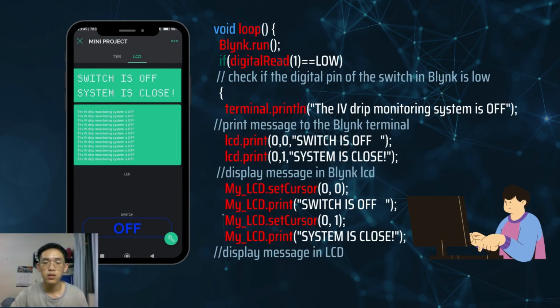Next, the code continues with void loop. Under this, the code will loop and execute line by line. The Blynk.run function enables the Blynk routine for keeping the connection alive, sending data, and receiving data. Then, the if statement checks the state of the switch, which is initialized by pin number 1. This switch is turned off by the nurse using the Blynk app, and it causes a temporary close of the system when the nurse acknowledges that the IV bag needs to be changed. The switch is turned on to continue the monitoring system.